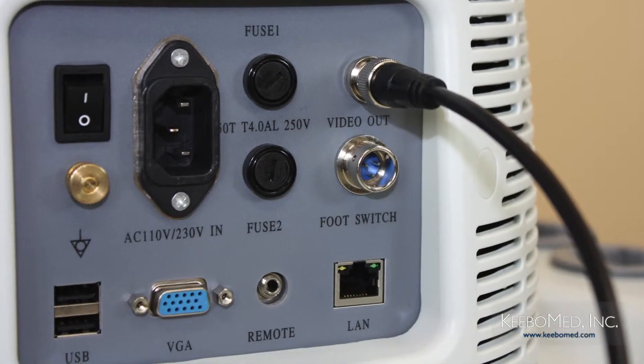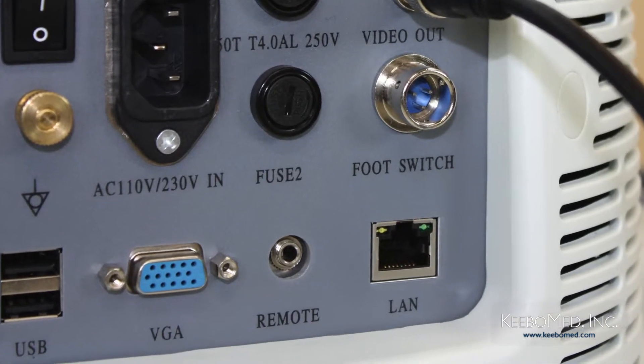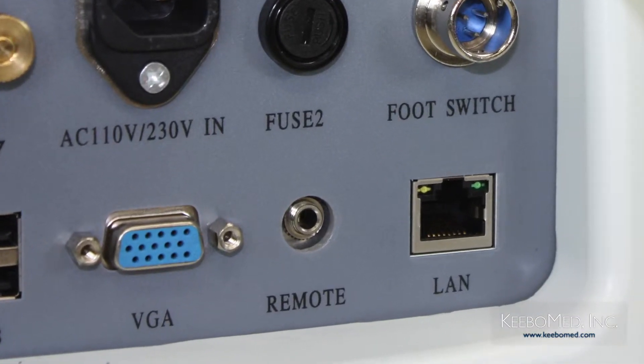Connect the other terminal of the remote control cord to the remote port at the rear panel of the ultrasound.